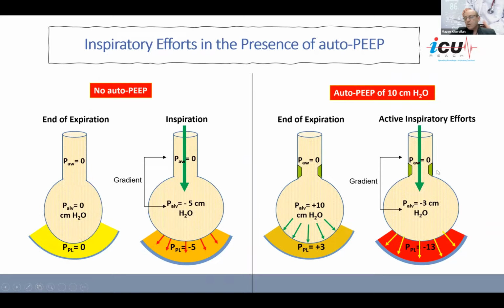So if you add PEEP to the system, that plateau pressure will go above that PEEP, and the PEEP will actually overcome the auto-PEEP that the patient is generating because of the dynamic hyperinflation. Adding the PEEP to the system means the plateau pressure is going to be higher now, because you're going to increase the plateau pressure higher than the PEEP in order to deliver the inspiration.